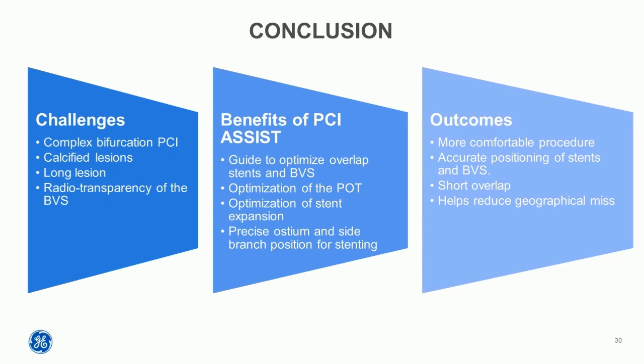It is also very useful when we use devices for long lesions, for DES, use of multi-DES, to optimize the overlap, to optimize the coverage of the lesion, to be sure that we don't have any geographical miss.